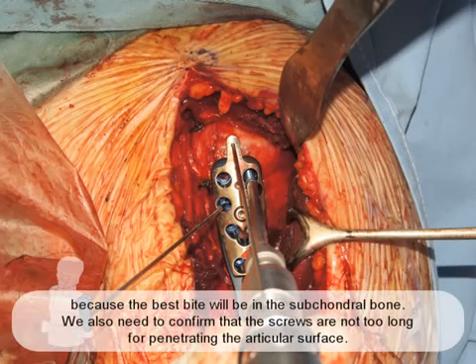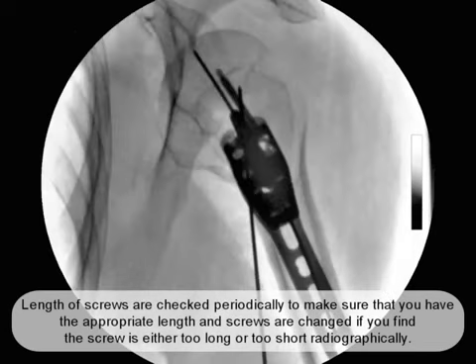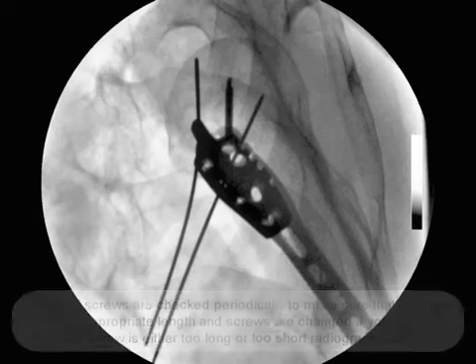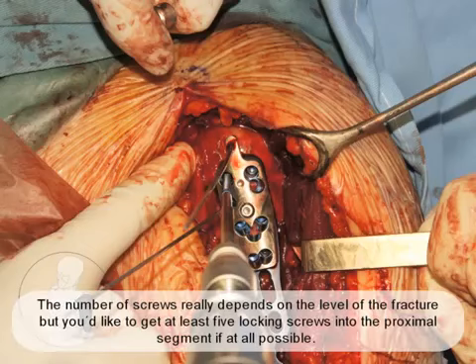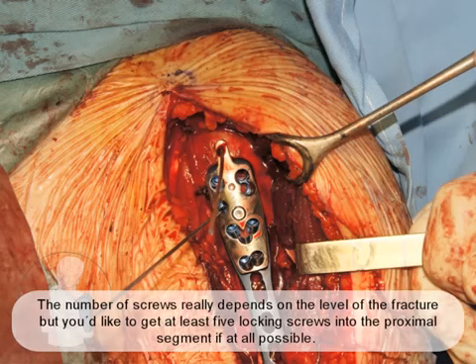We also need to confirm that the screws are not too long, penetrating the articular surface. Length of screws are checked periodically to make sure that you do have the appropriate length, and screws are changed if you find the screw is either too long or too short radiographically. Screws are placed in serially, once again making sure the screws are appropriate length, getting adequate fixation. The number of screws really depends on the level of the fracture, but you'd like to get at least 5 locking screws into the proximal segment, if at all possible.